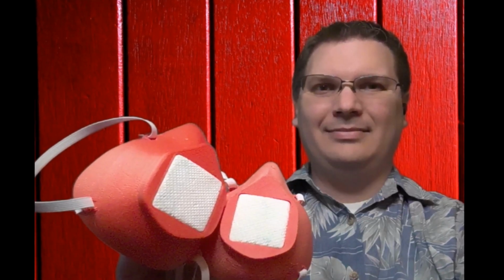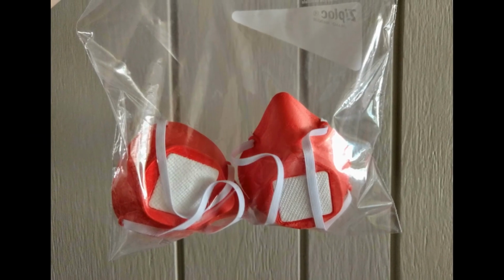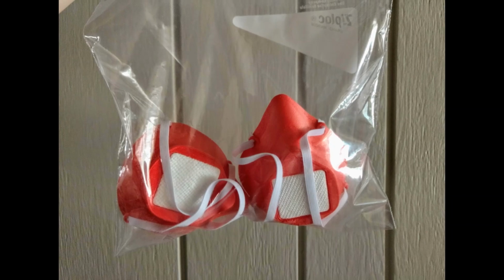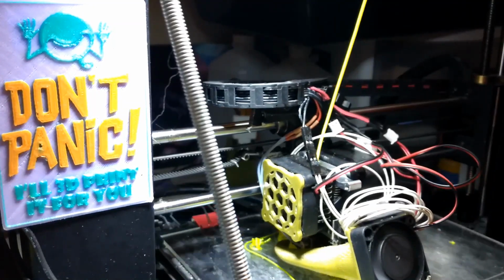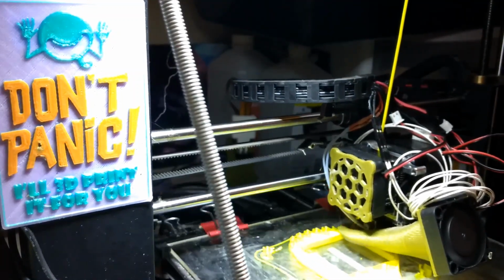Also designed it so that it can be printed in two different sizes for larger and smaller faces. Put it in a Ziploc bag and you can sterilize this very easily. Take it to your friends wherever you need it to go. And remember, don't panic. We can 3D print it for you.